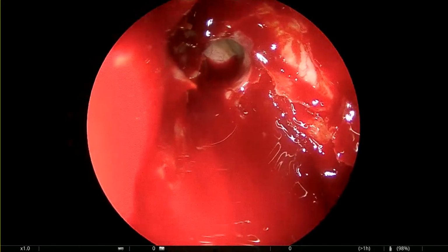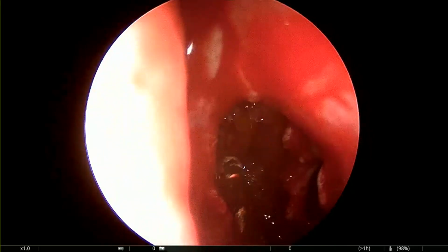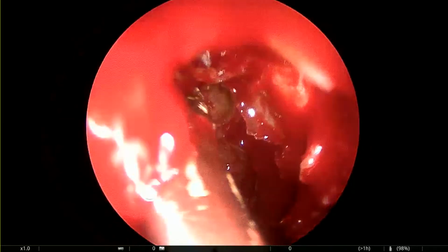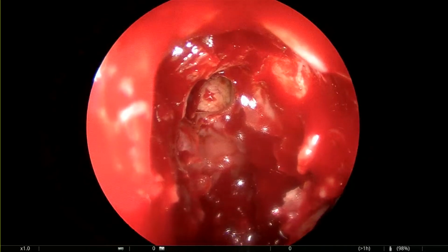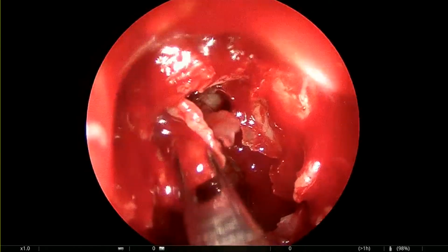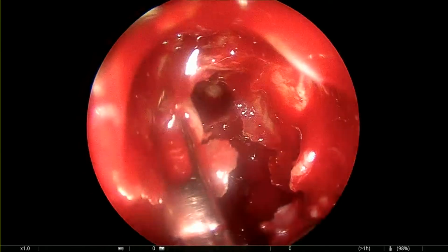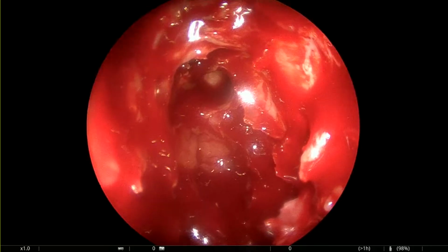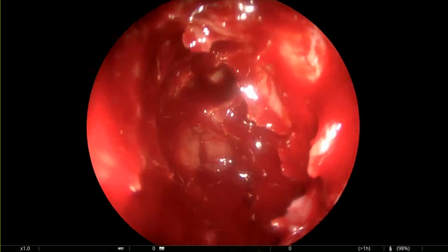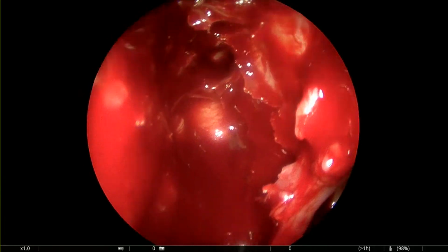So I do the anterior ethmoidectomy to have some margin and to control the contents of this space, but in fact it's not, and to organize the follow-up, because the follow-up is not with image but with endoscopy. Okay.